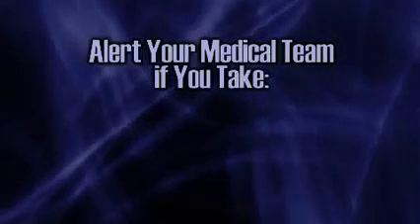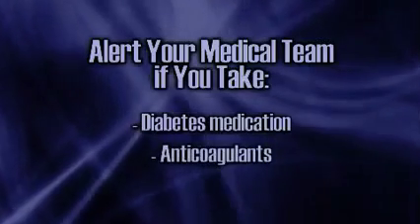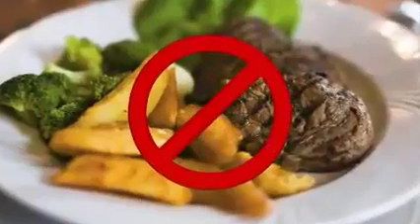It's especially important to let them know if you take medicine for a diabetic condition, or if you take anticoagulants, sometimes called blood thinners. You'll be given instructions in advance that will outline what you should and should not do in preparation for the upper GI endoscopy. Be sure to read and follow these instructions. It's very important that you not eat or drink at least 4 hours before your procedure. Be sure to discuss your doctor's recommendations.